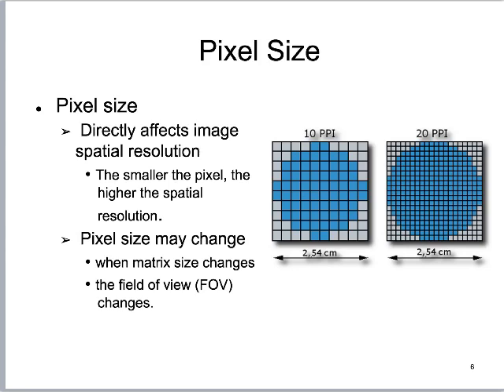Now the problem with a digital image is everything that you're making bigger is little tiny squares. In reality, as I get closer and closer to something, what I'm making bigger is little tiny atoms. And I cannot see an atom, so I cannot exhaust the detail that I'll be able to see, right? Unless I get down to some microscopic level. I know that's kind of weird. We will be returning to it over and over and over again.